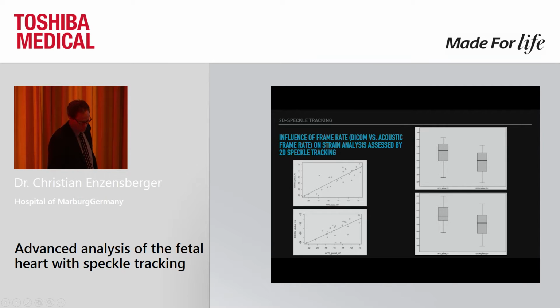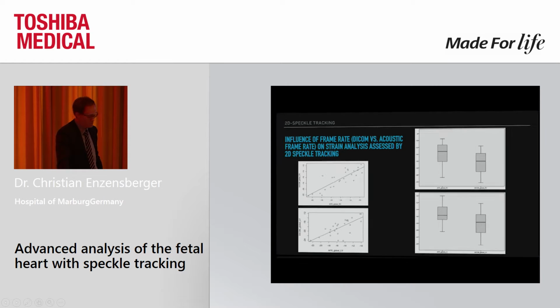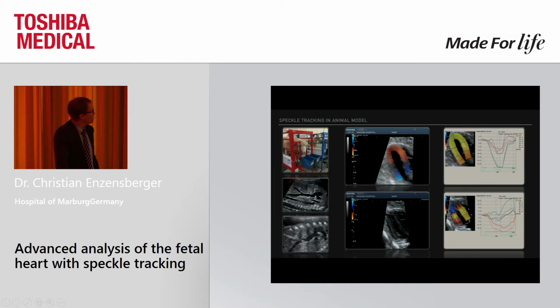Now, just to show you not only normal cases, as a new technique, you also want to see how it works in pathological cases.